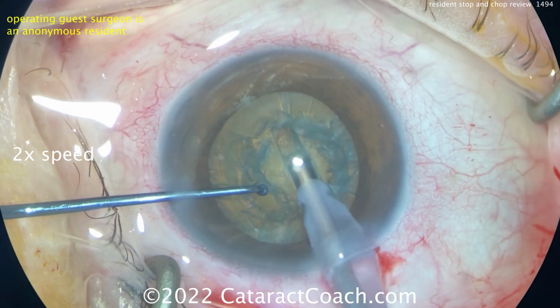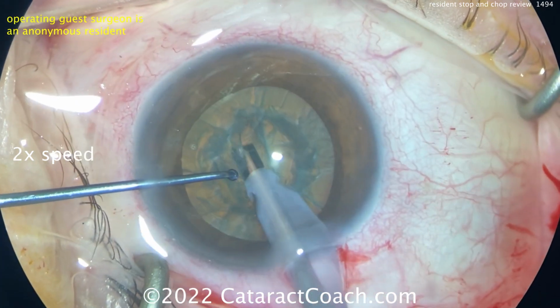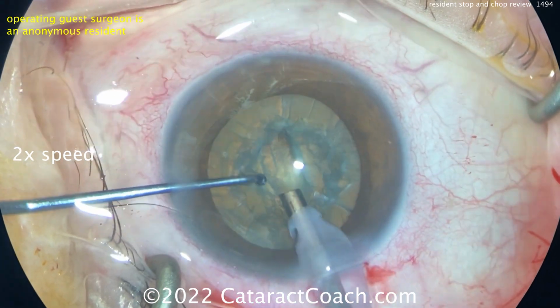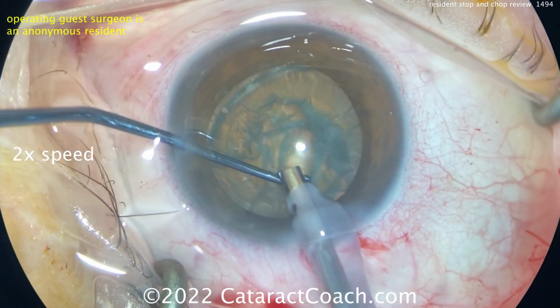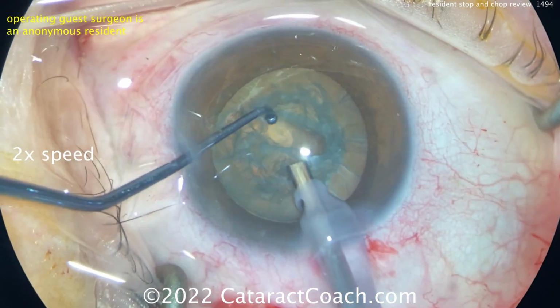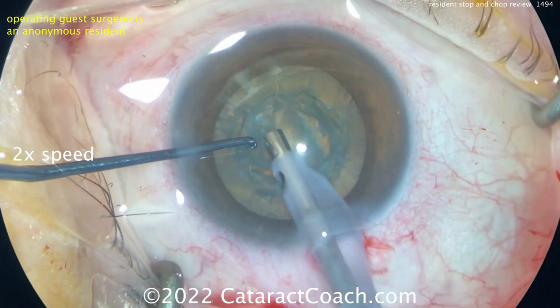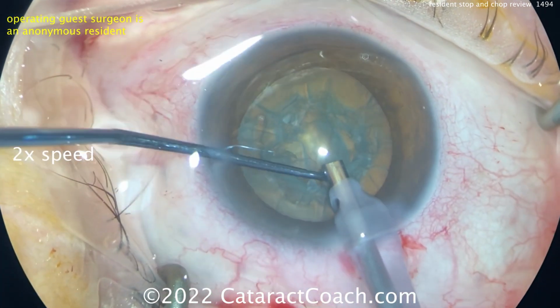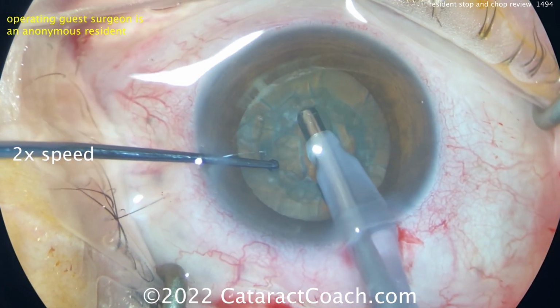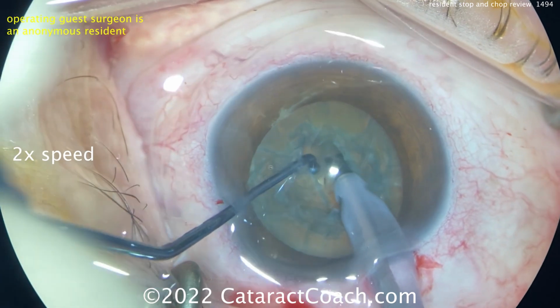I like the starting of the groove sub-incisional, which is being done here, and nicely grooving down the middle, slightly widening the groove. I like that as well. And now going a little bit wider on that, rotating the groove 180, and continue to sculpt this groove. Good job. By rotating at 180, you can get that former sub-incisional area and do a little bit more grooving there. And with a softer nucleus, you may have to groove more.